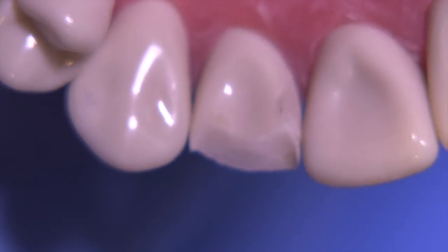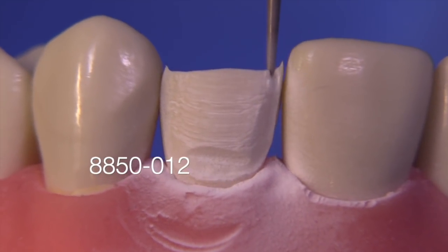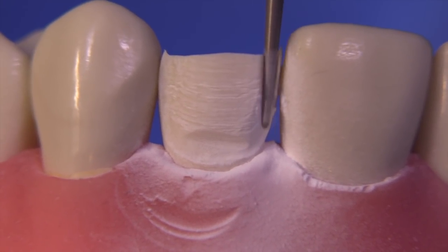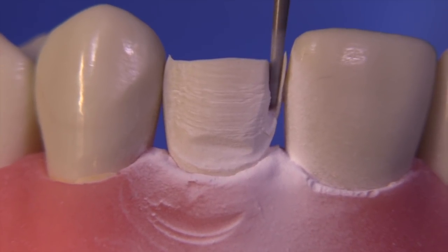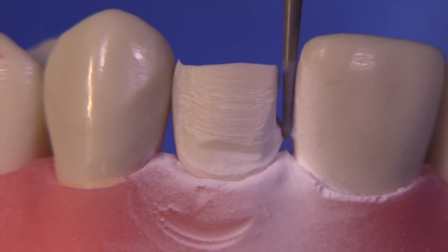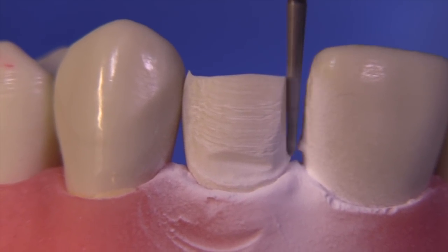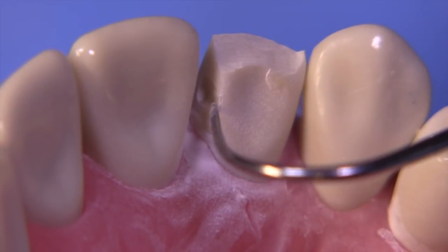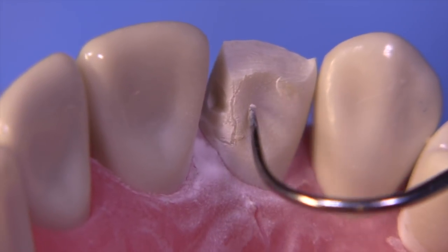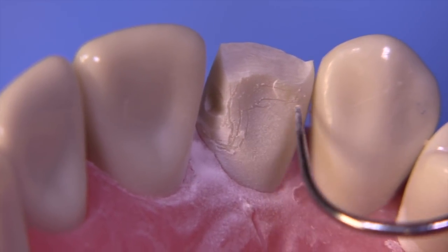Look at that class 3 composite — it's going to be included in the outline form of this particular preparation. I'm going to break through the interproximal with the 8850-012. You can see that the class 3 composite popped out while we were prepping, and we're going to want to extend the outline form to include it and wrap over the lingual significantly in order to get more retention form.